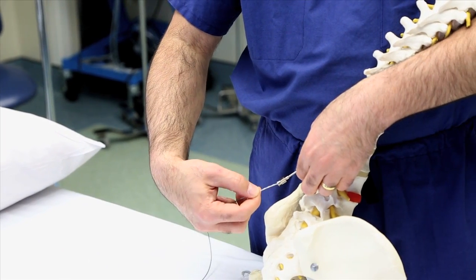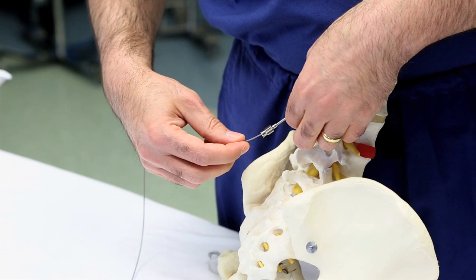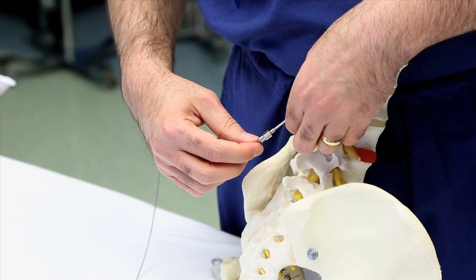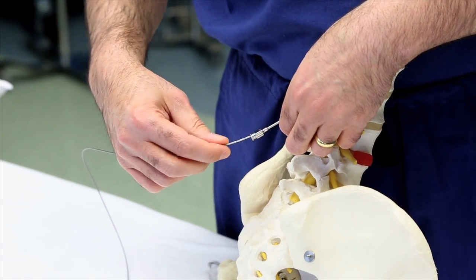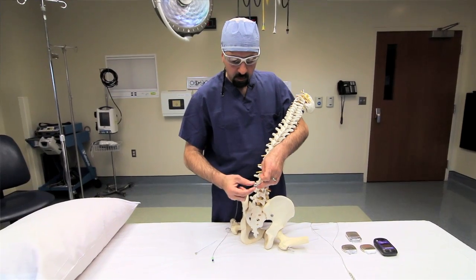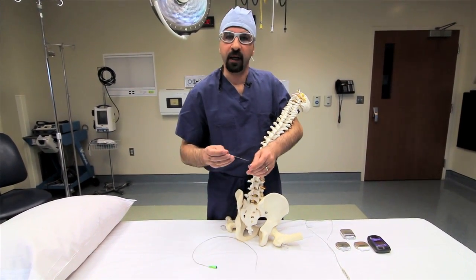We introduce the lead through the epidural needle and advance the lead up into the posterior epidural space to what we call the sweet spot. The sweet spot is a spot where, when we stimulate, it covers all the patient's painful area.